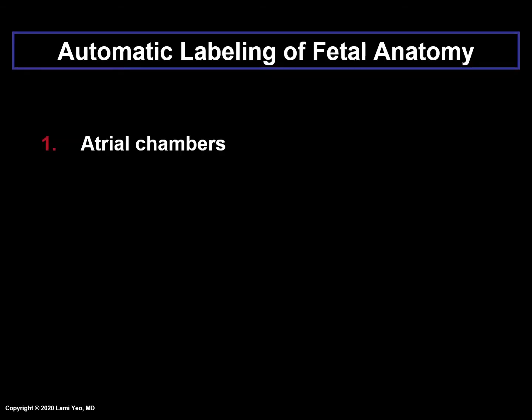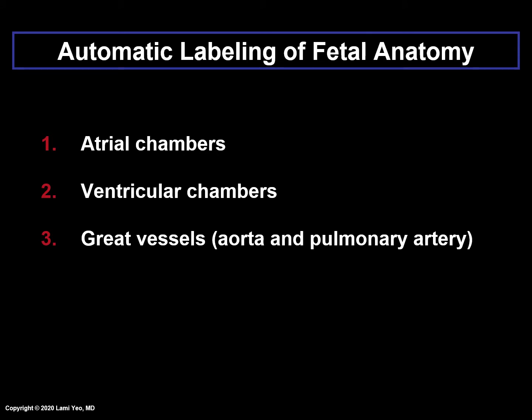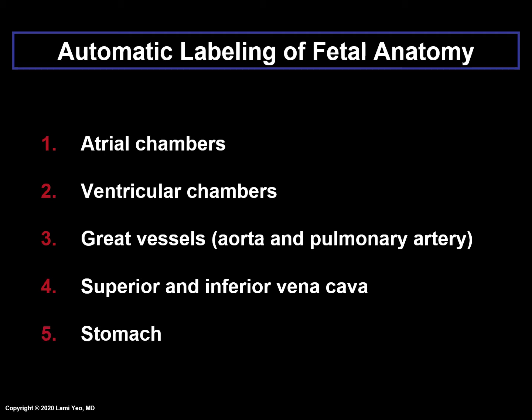The fetal anatomy which is labeled automatically includes the atrial chambers, ventricular chambers, great vessels — the aorta and pulmonary artery — superior and inferior vena cava, and the stomach.